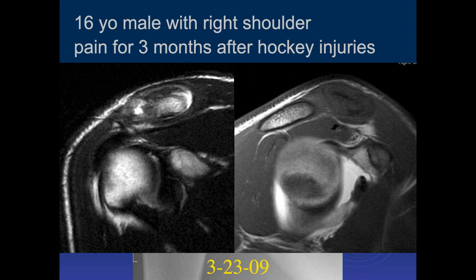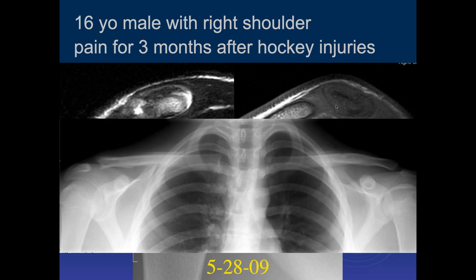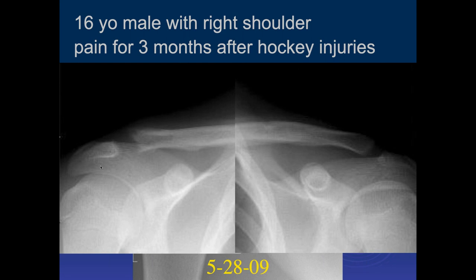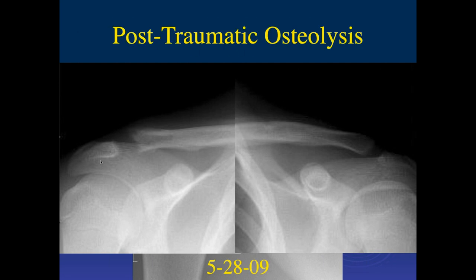What are you thinking? Distal clavicular osteolysis. You can see that the right side is abnormal compared to the left. You see it in weightlifters — chronic repetitive trauma. It's the distal clavicle, and you get bone resorption because you keep irritating it and don't allow it to heal. You end up with separation. So this is post-traumatic osteolysis.